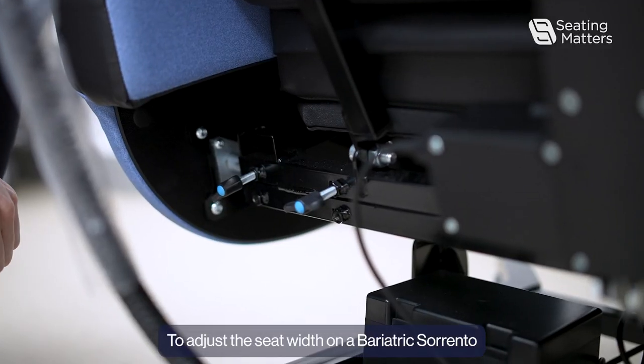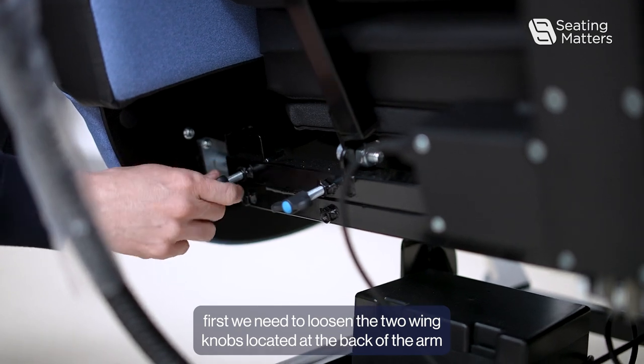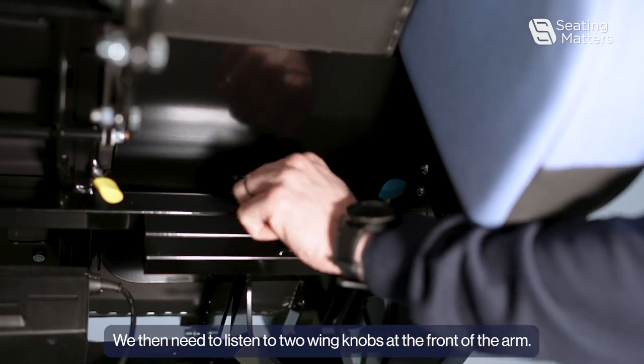To adjust the seat width on a bariatric Sorento, first we need to loosen the two wing knobs located at the back of the arm for each arm. We then need to loosen the two wing knobs at the front of the arm.